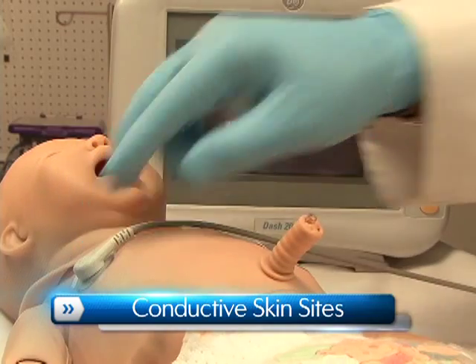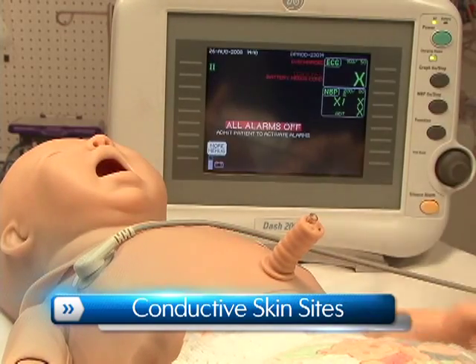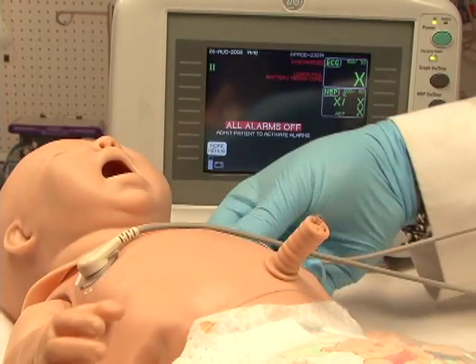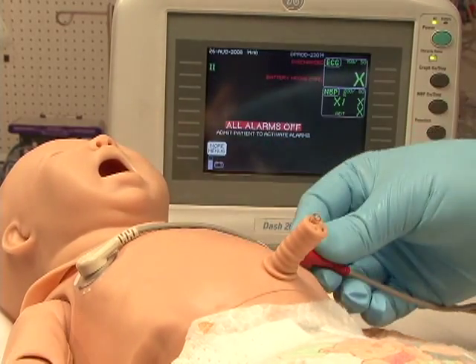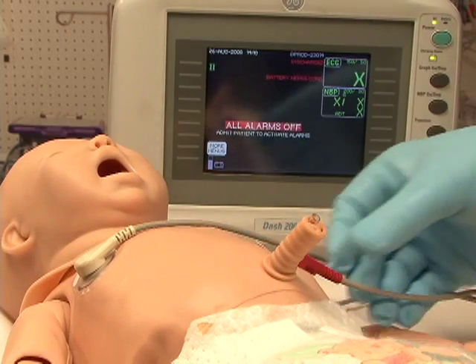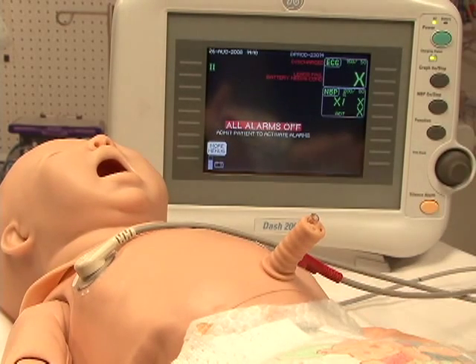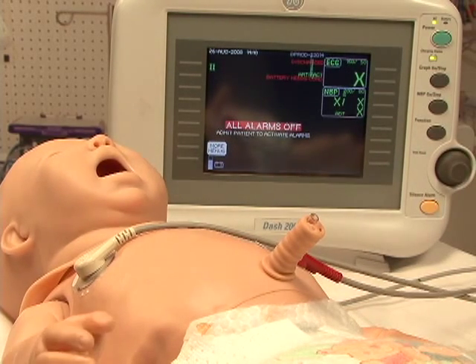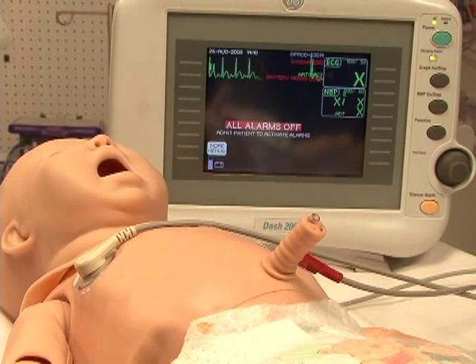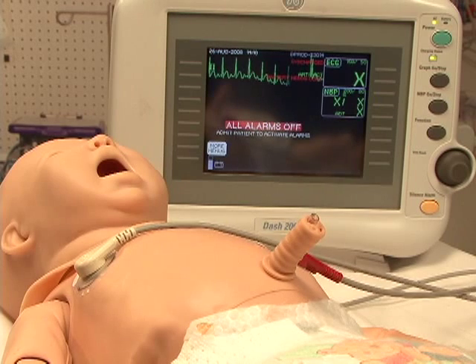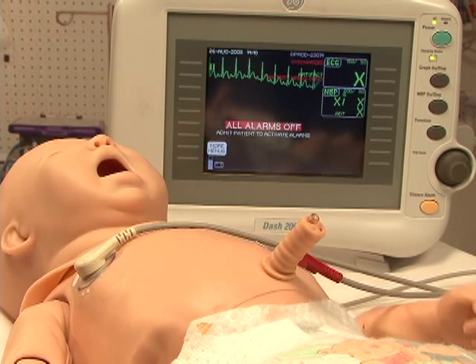Newborn HAL's conductive skin sites allow the attachment of real electrodes. This feature permits the user to track cardiac rhythms and events with their own equipment, just like with a human patient.